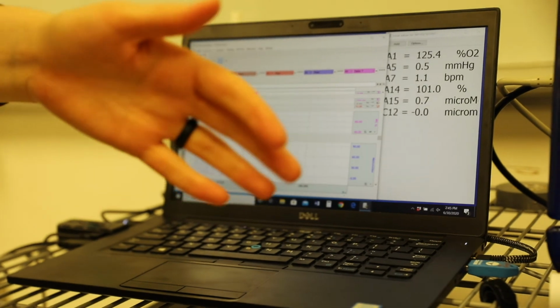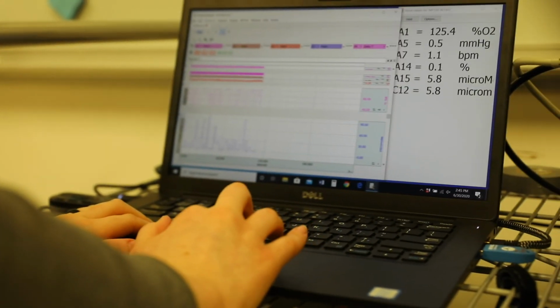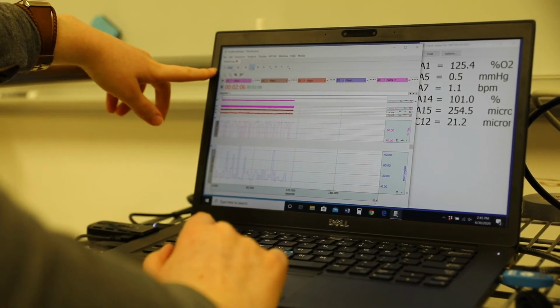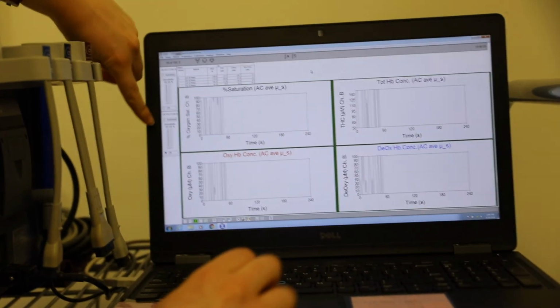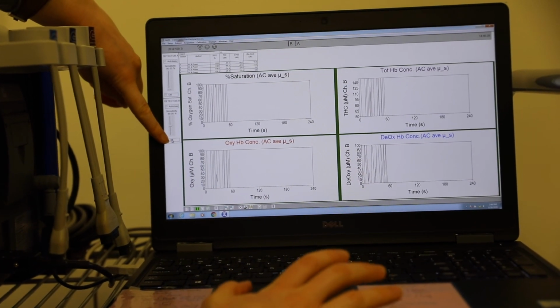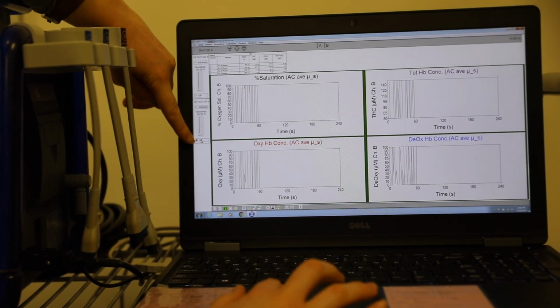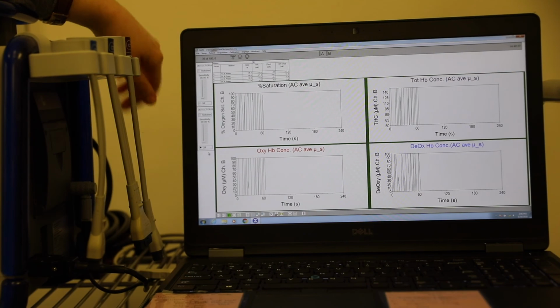So then once the subject is done with the test for this study with the NIRS, all you have to do is come over here and click Stop to stop recording the data, and then you're going to come back over to the other computer and we're going to click on the off button so that the bar comes down to the bottom, and it's now off. So now the probe is safe to take off of the subject.